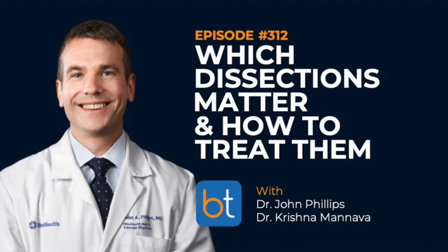And those that have some residual plaque or a dissection, we'll put a drug-coated stent in if need be, or I like using the tacks in that situation because it can limit some of the metal. Thus far, we've had pretty good success with it. I understand the cost of DCB and whatnot, but I do think it should be standard of care, in my opinion. What about medical adjunctive therapy with tacks?